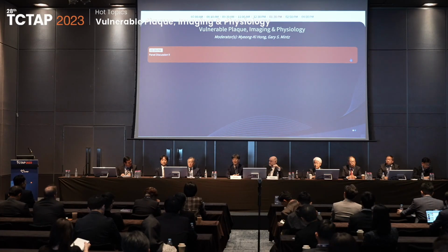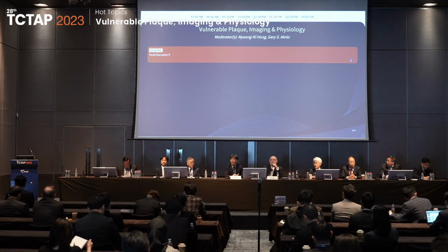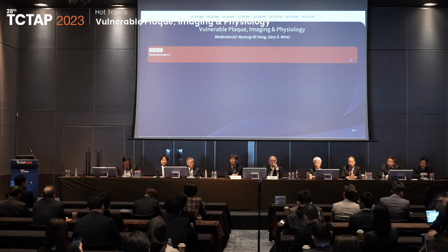I have one question to Dr. Park. The physiologic expert said that the physiologic study may predict plaque vulnerability. As the FFR value is lower, the vulnerability accordingly increases. So when we examine the patient, what is the cutoff value? What defines this plaque as vulnerable or not?